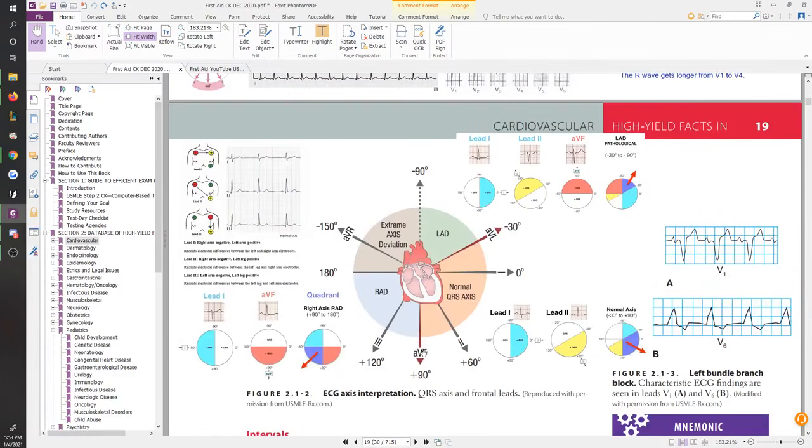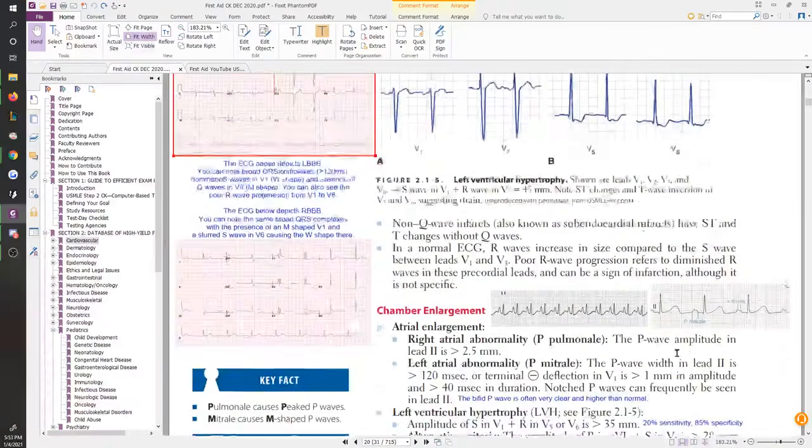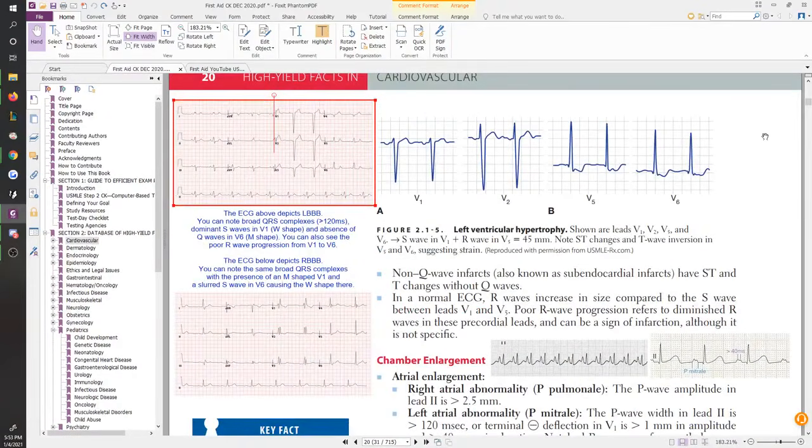They can't because you lost this area. The left heart is pointing so much towards the left side, it's working so much more powerfully to the left side that the axis shifted towards this green environment, moving away from 2 and aVF. So now 2 and aVF point downwards. So let's take a look at these. They didn't give you the full ECG, but I have more further in the book for full ECGs. It's better to look at full ones. But this is just to get a point across.